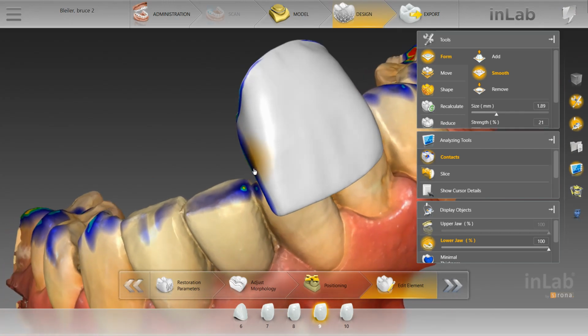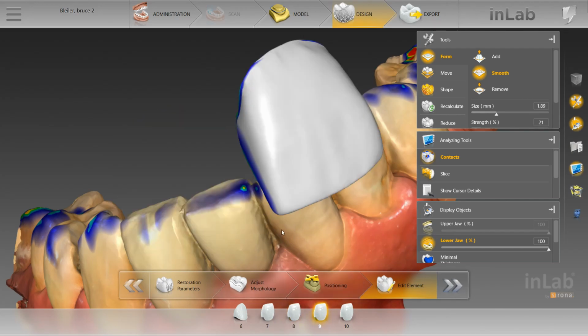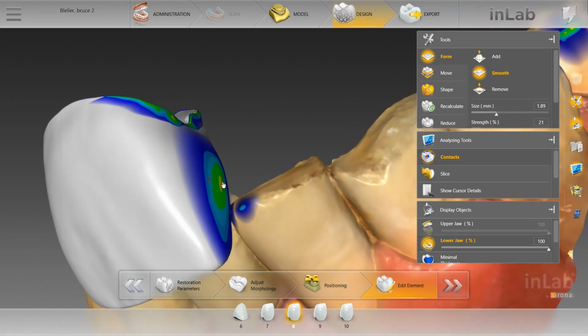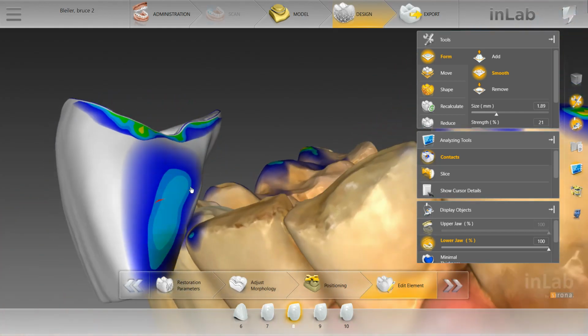So we're going to continue to look at this head on from the facial and make sure that this line is straight over here as well. And if you look, this looks straight, but we have contact right here. Then if you pull up number 8, this is straight, but where there's contact, it looks like this, there's a bump right here. So we're gonna take that out. So now we have no contact, but we're headed in the right direction.